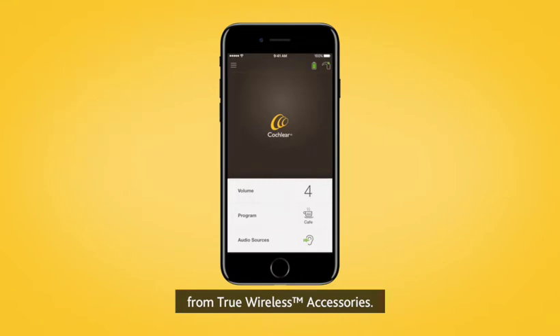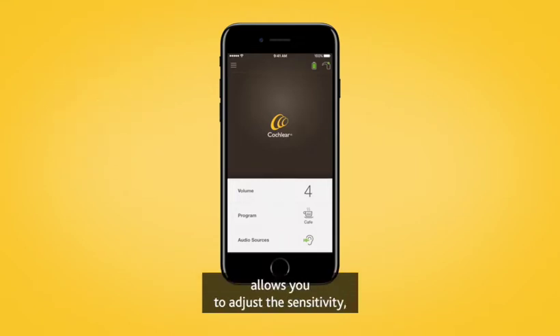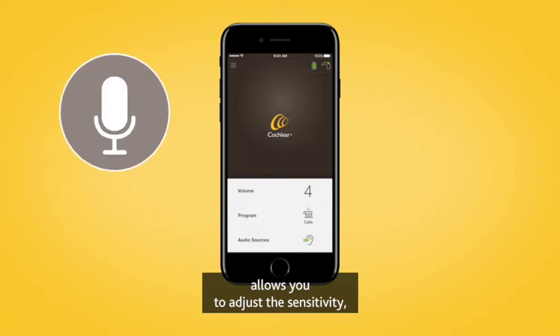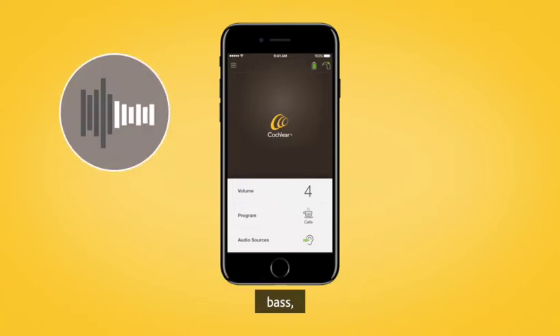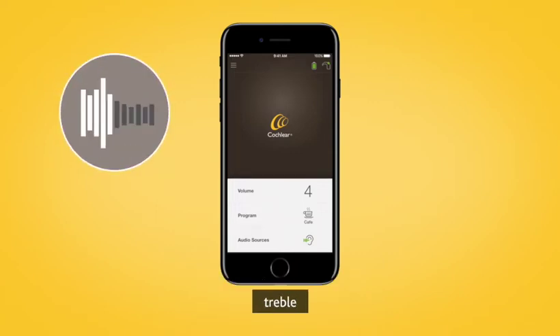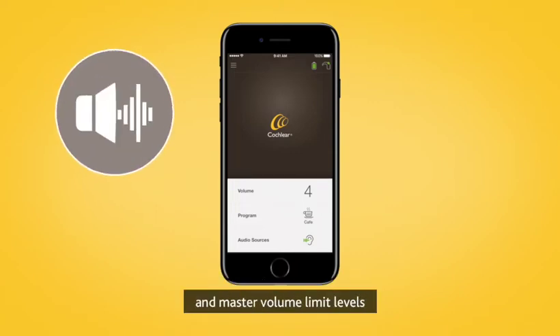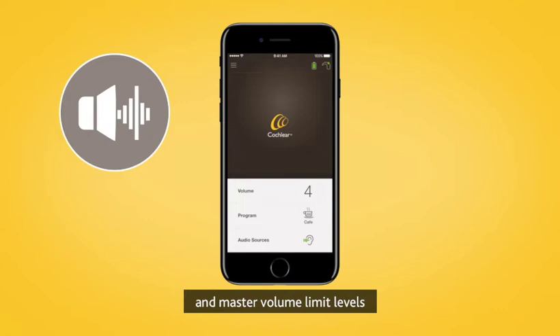The Nucleus Smart App allows you to adjust the sensitivity, bass, treble, and master volume limit levels of your sound processor.